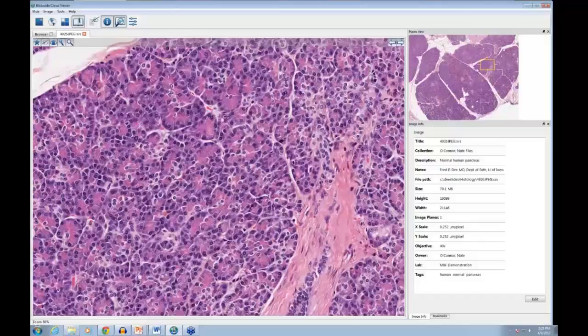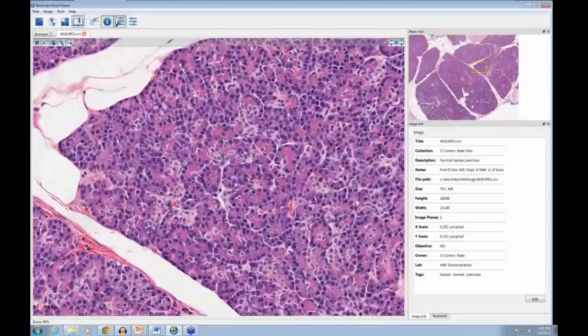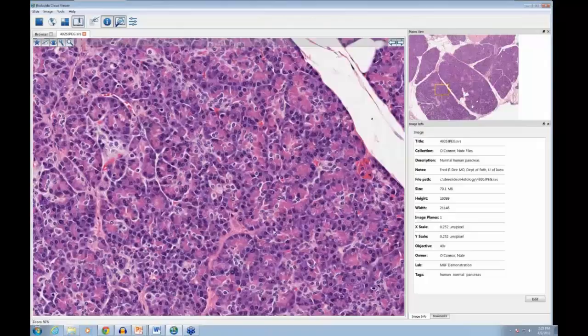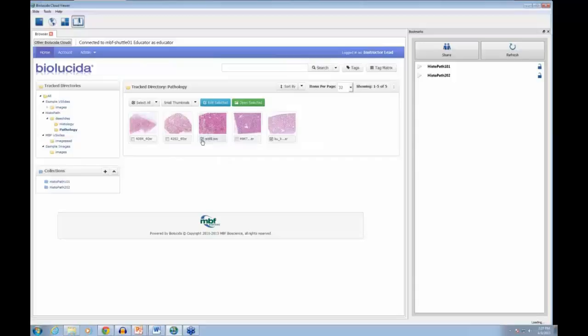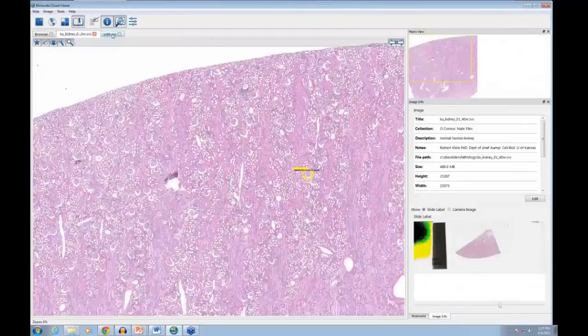That makes navigation pretty easy — together with the macro view, you can click anywhere and be immediately at that location. It's a very nicely preserved and stained pancreas. You can also view more than one image at a time. Let's jump into the pathology directory — I'll open a normal human kidney and a renal cell carcinoma by checking both and opening them.